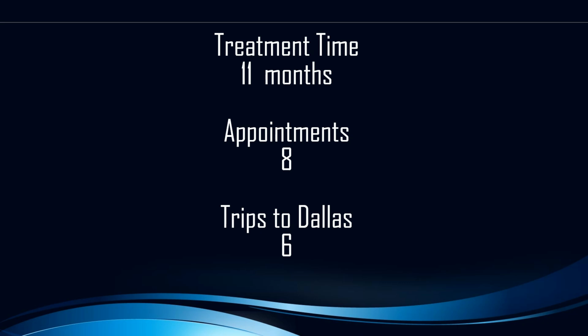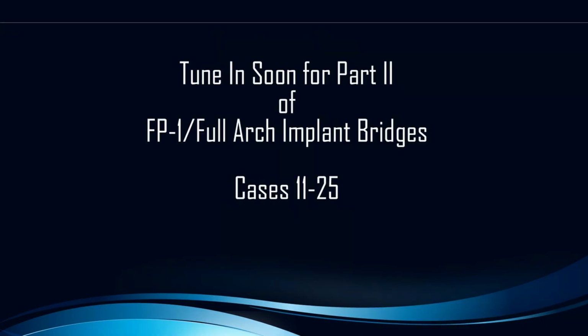We want you to get an outcome like these 10 cases, not like you saw on the all-on-4 slides I showed you earlier. And finally, I'll have the other 10 or 15 cases to show you in the next few weeks, maybe a month or so. I'll look forward to that.